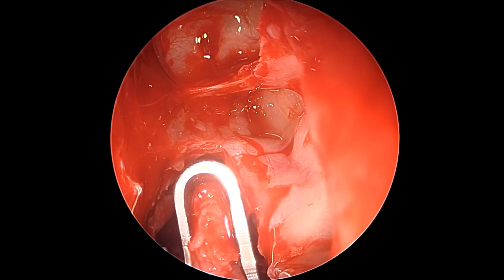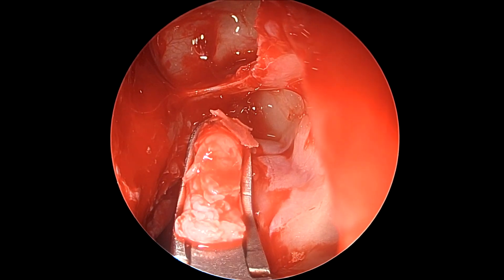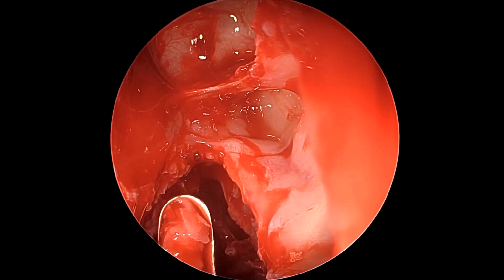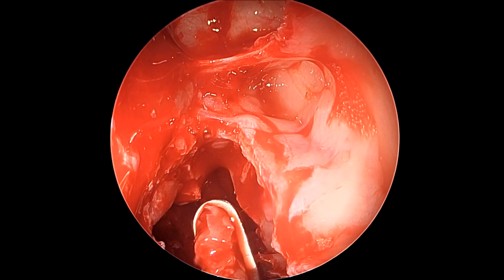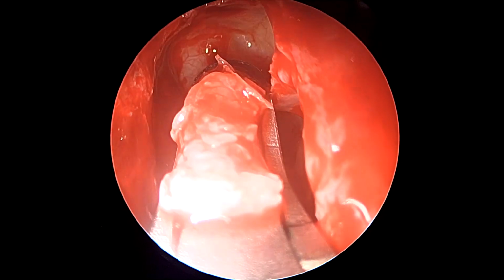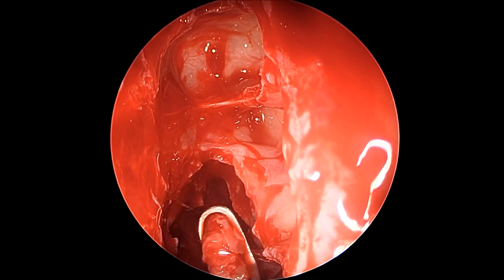Now you can see how deep these septations can be. And each time when we palpate these septations, we have clear knowledge of the depth of these septations and hence the height of the skull base, and how deep our instruments must go when we access these.